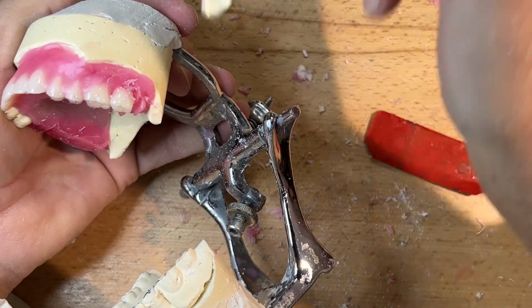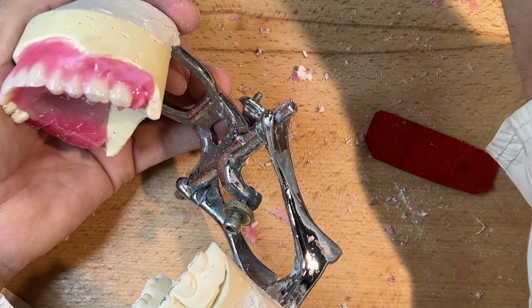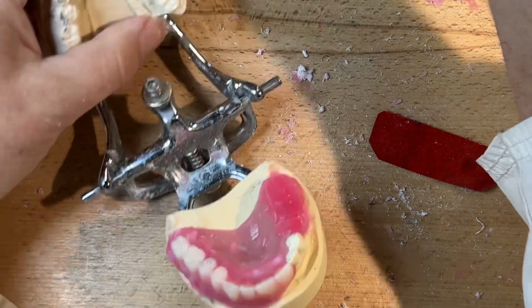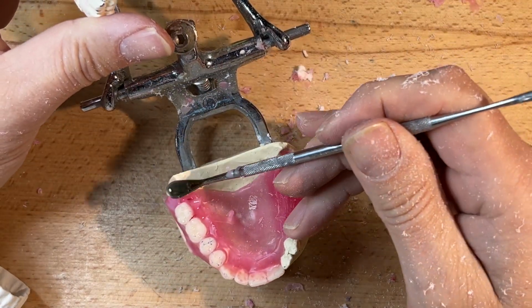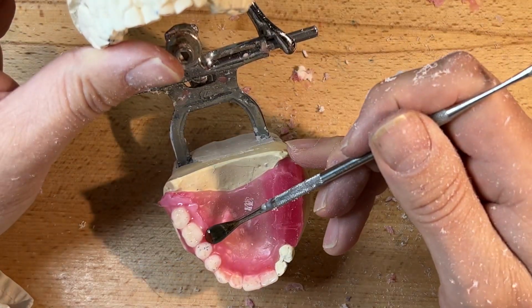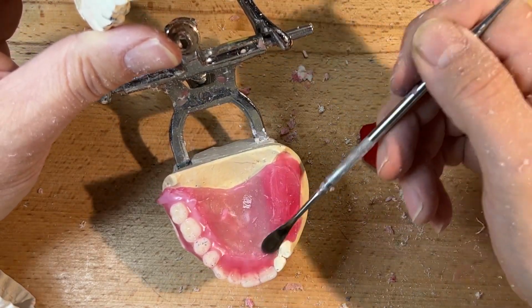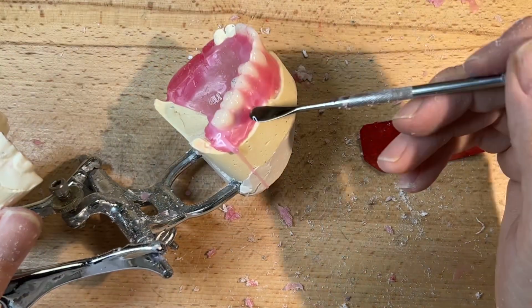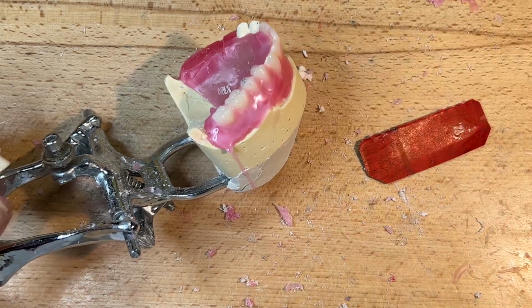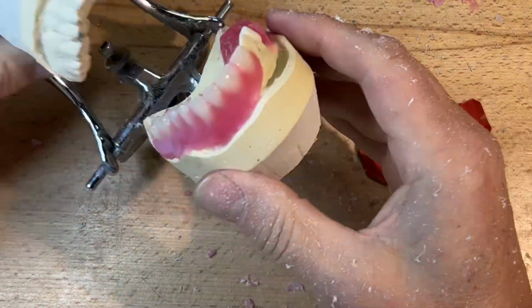I guess you can check the length of this video, which would be an average time. I'm not rushing, nor am I taking an excessive amount of time. I think this would be, let's say, average. I mean, we don't have to rush everything. We can enjoy the process. Try to do some due diligence of the job. The length of the video will be start to finish of basically a full upper immediate denture setup, with trimming of each tooth. Everyone tries to speed things up by just sticking them in there. We just don't slap the teeth together. We have to customize these occlusions, customize the excursions.